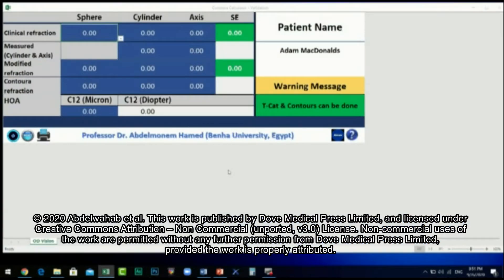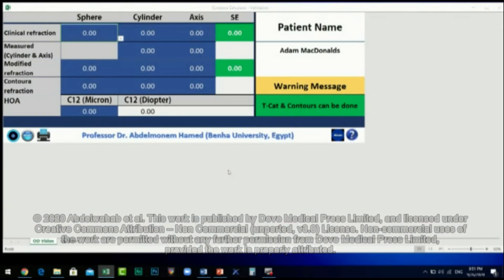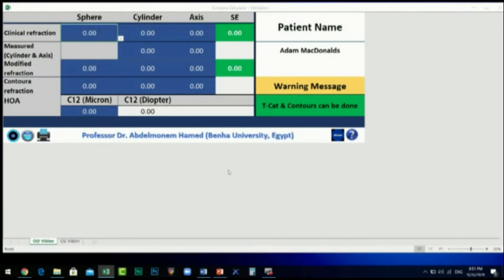You can see four columns and five rows. The column headings from left to right are: Sphere, Cylinder Power, Cylinder Axis, and Spherical Equivalent. The row headings from top to bottom are: Clinical Refraction, Measured Cylinder Power and Axis, Modified Refraction, Contour Refraction, and High Order Aberrations.